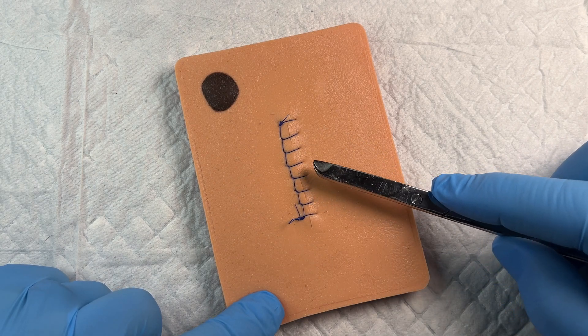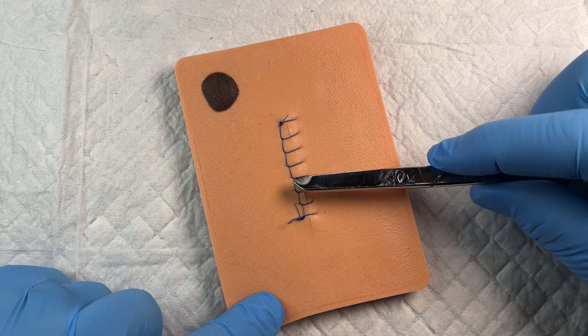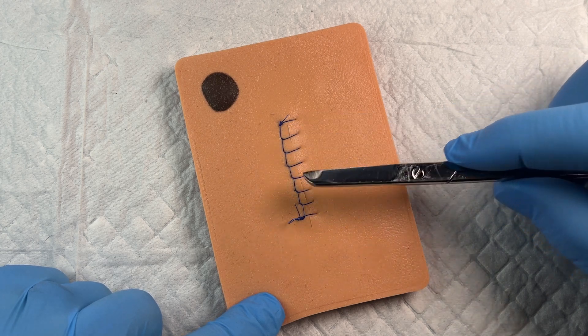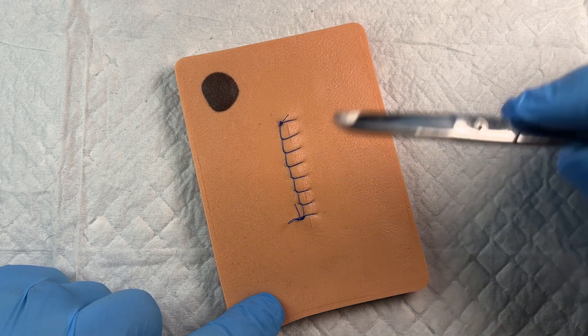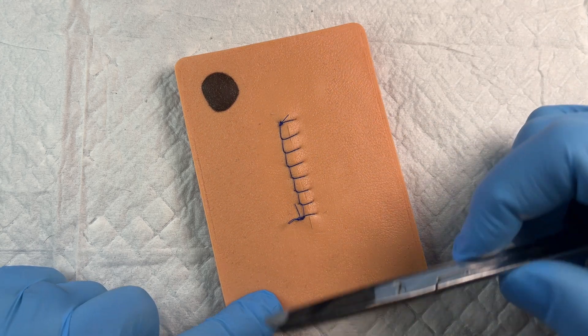That also is important to keep in mind as we are removing the suture because all of the suture that's on the surface, we want to remove this in a way that does not just pull that suture down through the tissue and track bacteria down through that tissue as well.